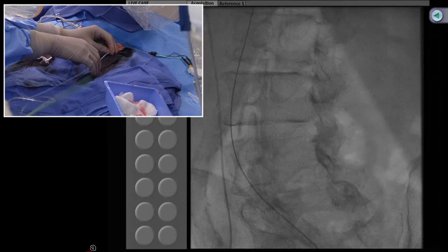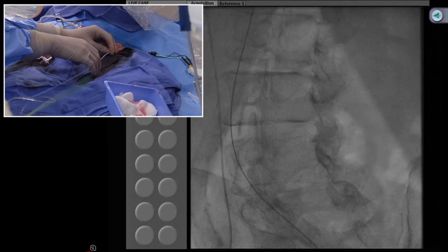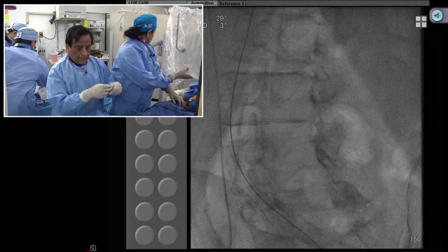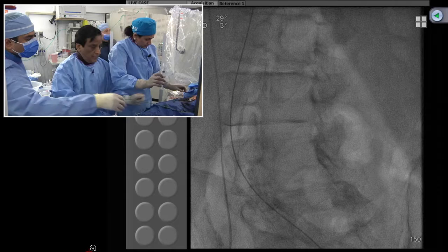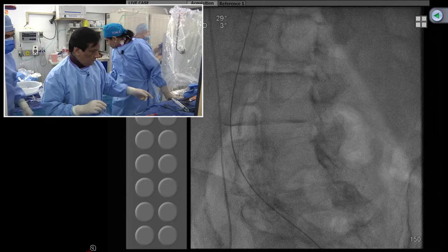We need to put a 7 French long sheath. This was through an 11 French sheath. Because of tortuosity, we are putting a 7 French sheath through it. We are giving an extra bolus of angiomax now.